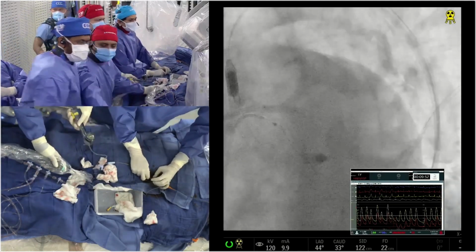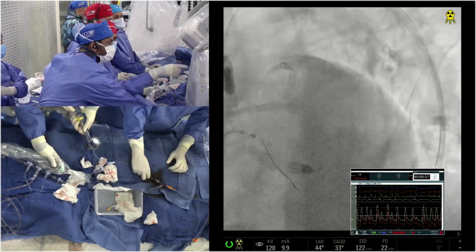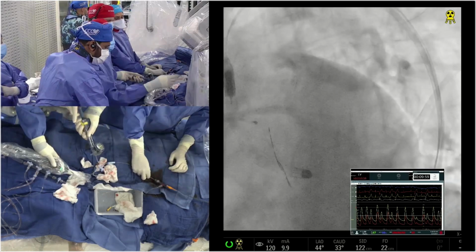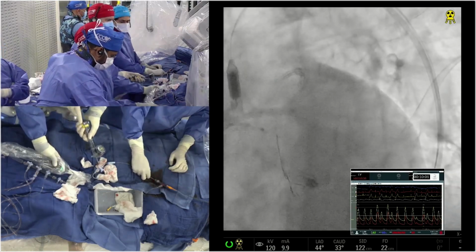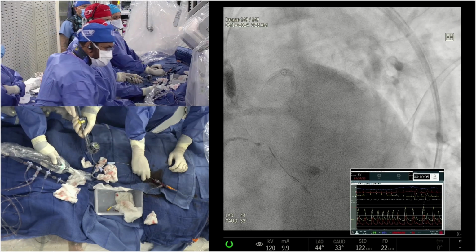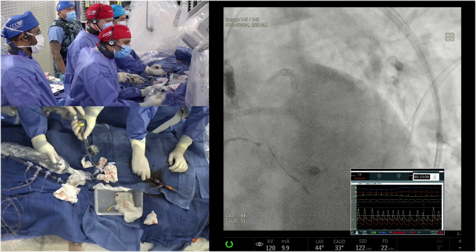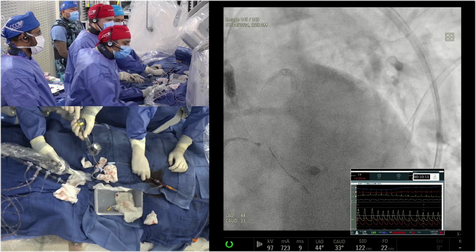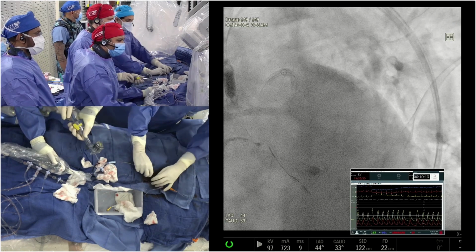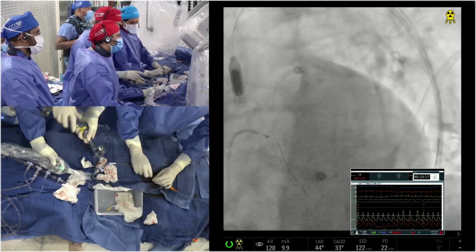You were worried about using Shockwave in the left main before, and here you are in the circumflex and obstructing. Yes. And I see that you're getting a little bit of hypotension. Yep. We see it. Look at the red one. Yeah, with the IVL in place, and you need to keep it there. Go down with the pulses and watch, and therefore Impella comes in handy here. Do you have it? Yeah.